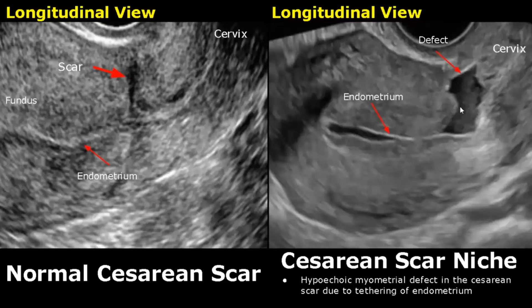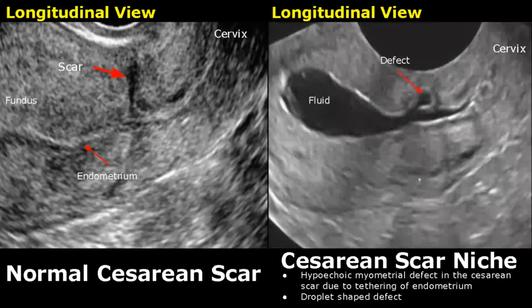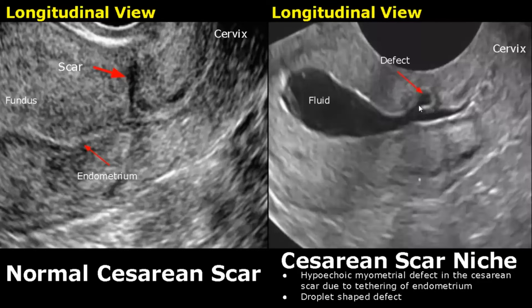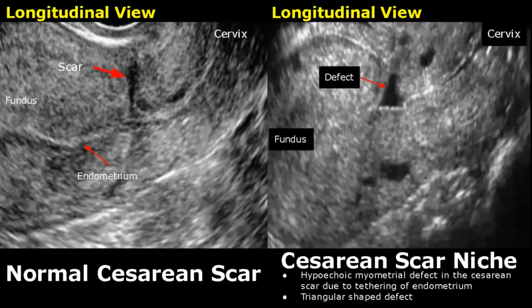The defect has various shapes. This is an irregular-shaped defect. This defect has a linear shape with endometrial fluid also present. In this image there is a large accumulation of endometrial fluid. This defect has a teardrop shape. Triangular-shaped defects are common as well — here we can see a proper triangular-shaped defect.